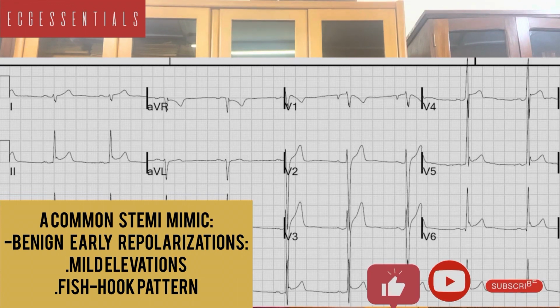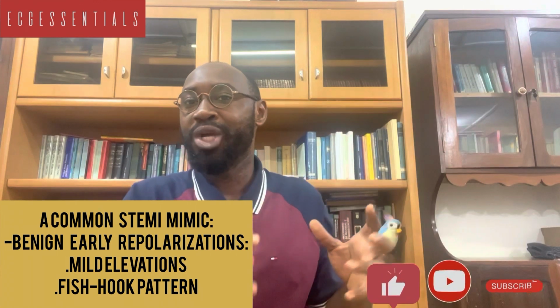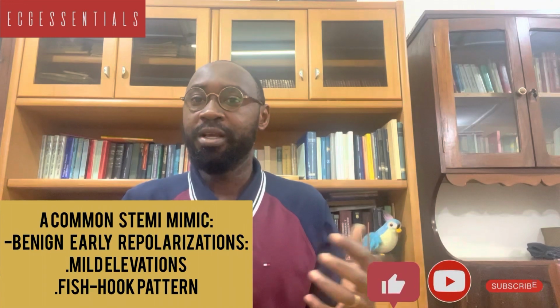And characteristically, they may have this fish hook pattern, which is like a notching around the J point. So when we see some of those features, particularly in the context where there is no chest pain per se, then we should not be too quick to diagnose a STEMI, but rather we may consider these as benign features representing just benign early repolarizations.